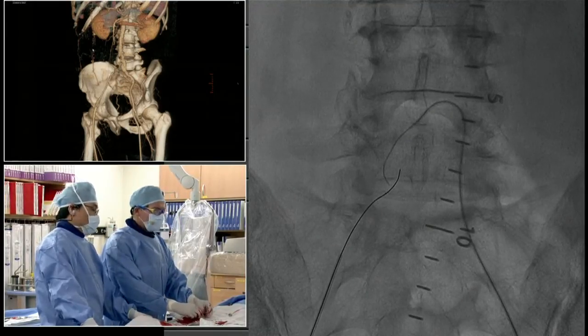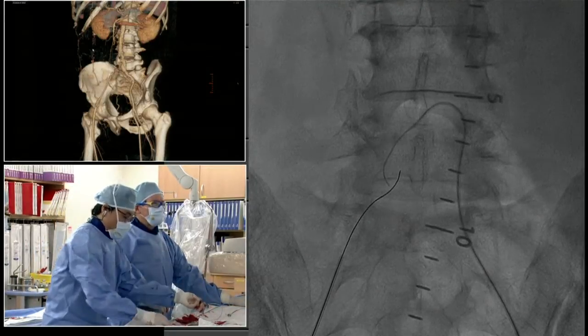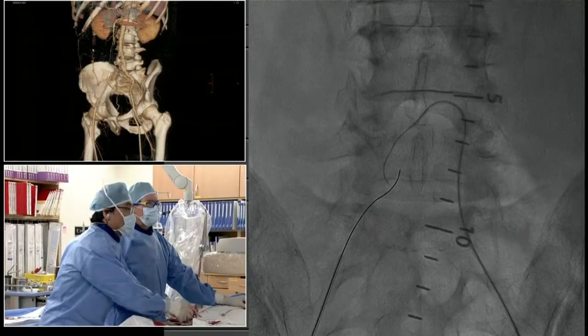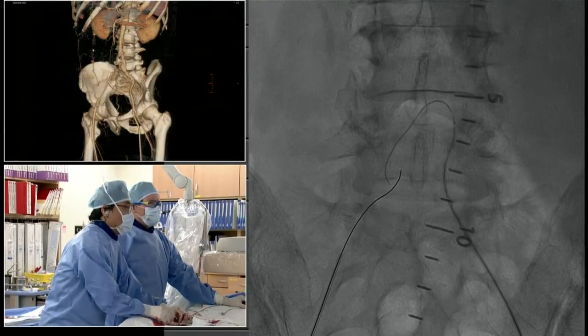We're going to try to take a great example of the IMA collateral. Yeah, keep the wire there, to the femoral too. Yes. So, Rich, you want to just talk to us a little bit about what you've done so far in your approach here?